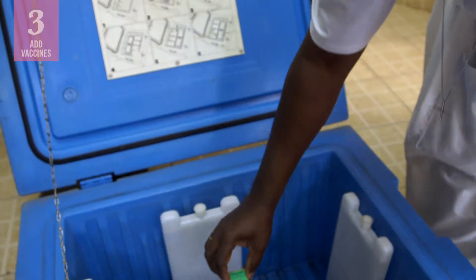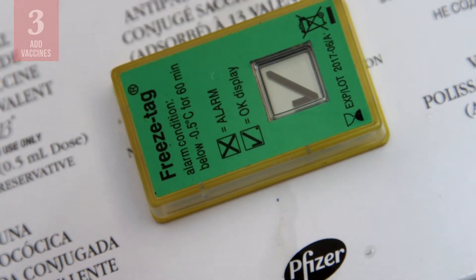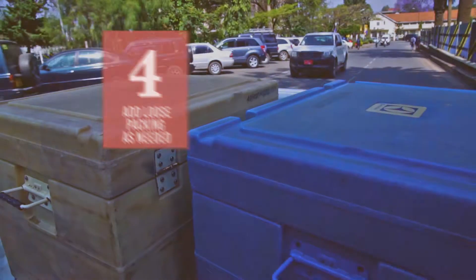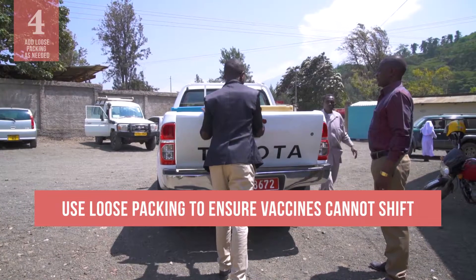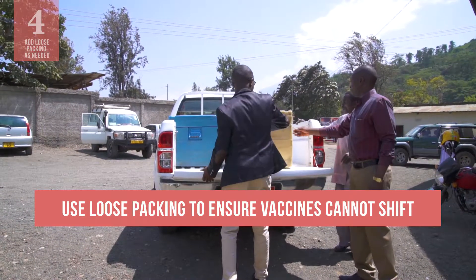If conditioned ice packs are used, put an electronic freeze indicator with the vaccines. If you will be transporting or moving the cold box, use newspaper or other loose packing to ensure that the vaccines cannot shift.